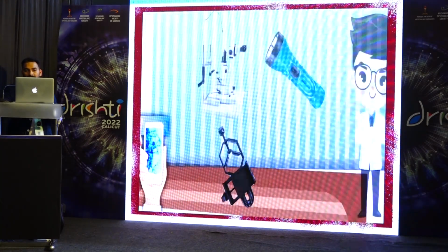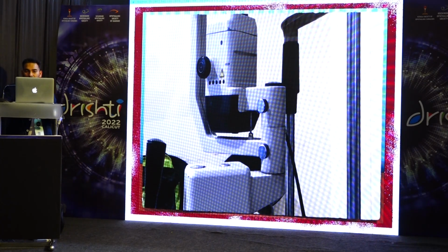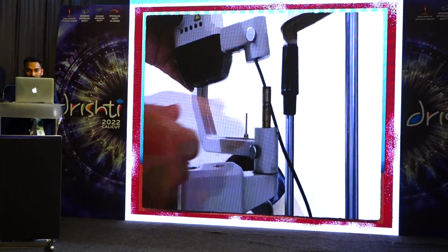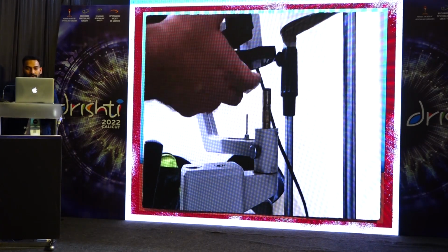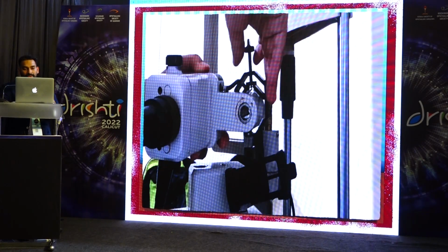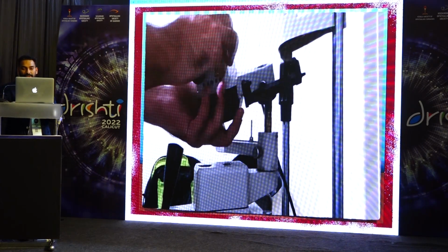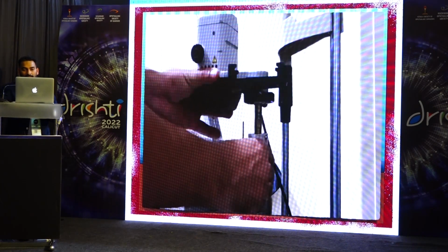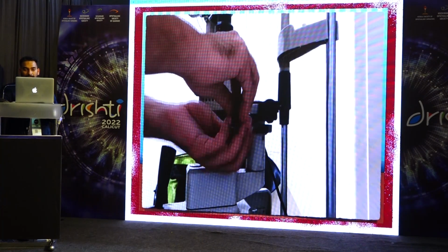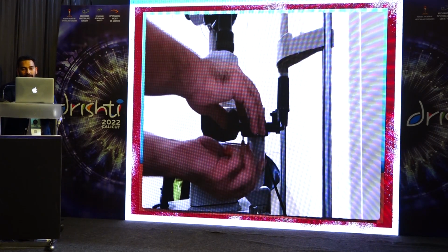Over here we'll show you how you can attach it. Either you can attach it by removing the illumination part, or you can put it on top of the illumination part, if there is a small hook. The phone adapter which we saw for smartphone slit lamp photography, the same adapter we are using here, but the arrangement of the smartphone is reversed. Usually you keep it towards the connecting adapter, right? So we keep it reversed.